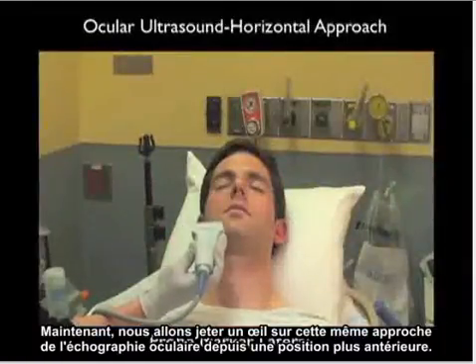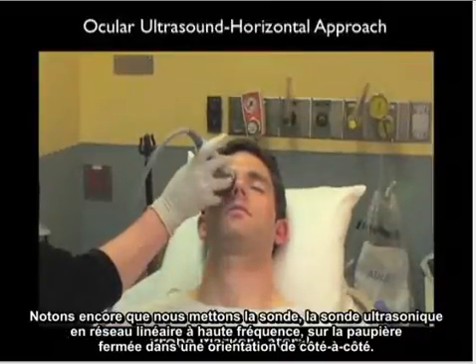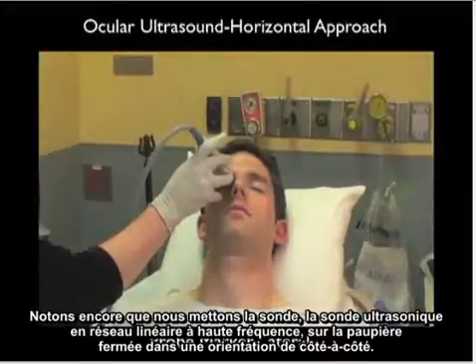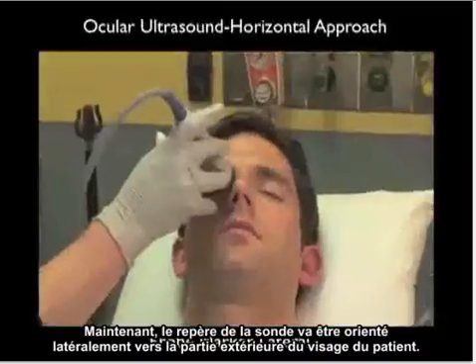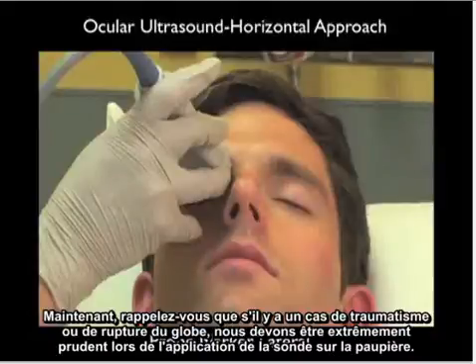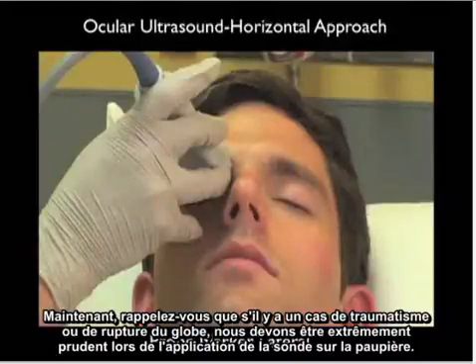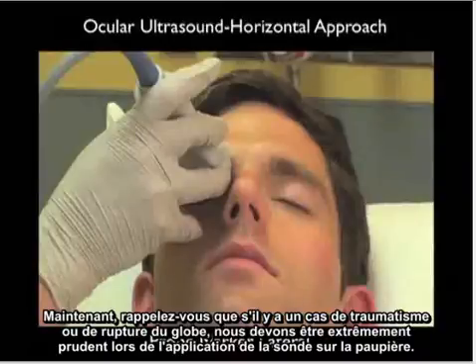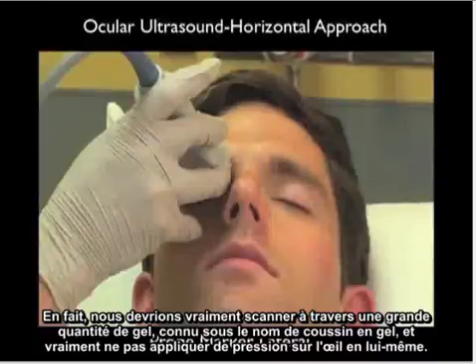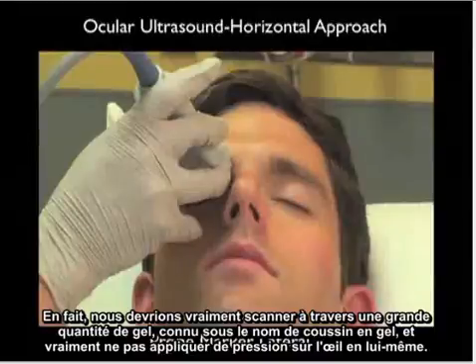Now let's take a look at the same approach from a more anterior position. We place the high-frequency linear array probe over the closed eyelid in a side-to-side orientation, with the probe marker oriented laterally. If there is any question of trauma or globe rupture, we must be extremely careful when applying the probe onto the eyelid. We should scan through a copious amount of gel — known as a gel pillow — without applying any pressure down to the actual eye.